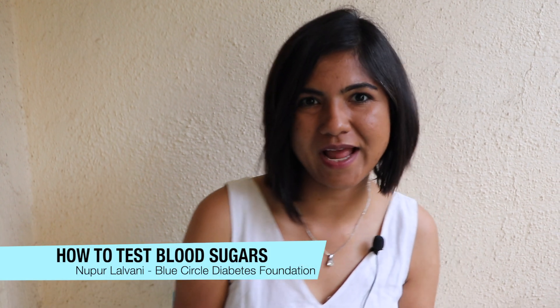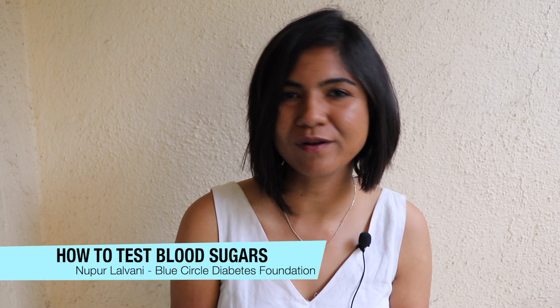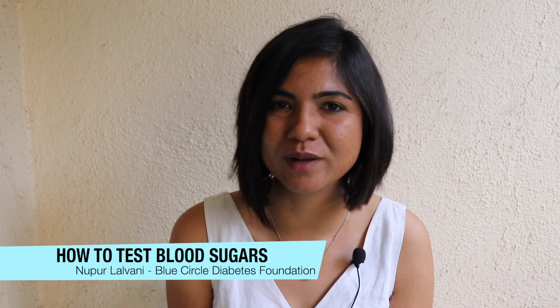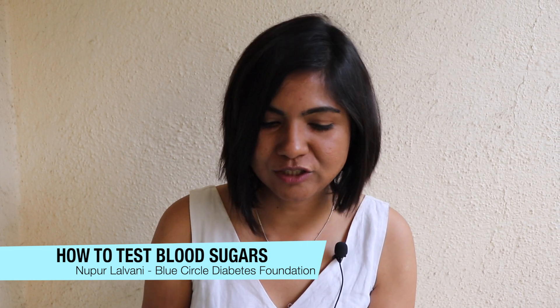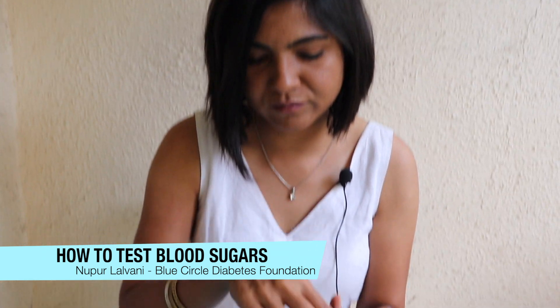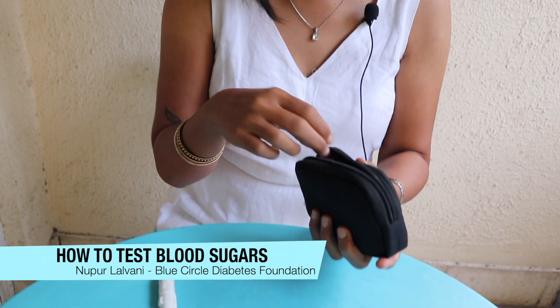Hi everyone, my name is Nupur and today we're doing a quick tutorial on how to use a glucometer to check your blood sugar. As diabetics, it's very important to keep checking our blood sugars — it's one of the main pillars of diabetes management.